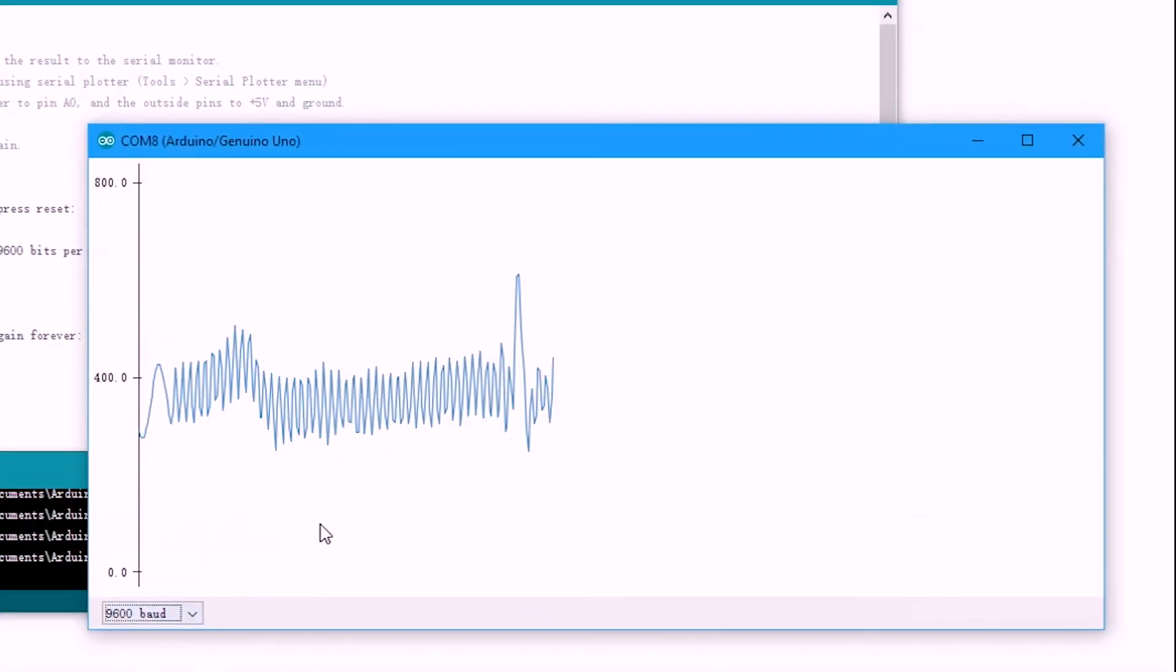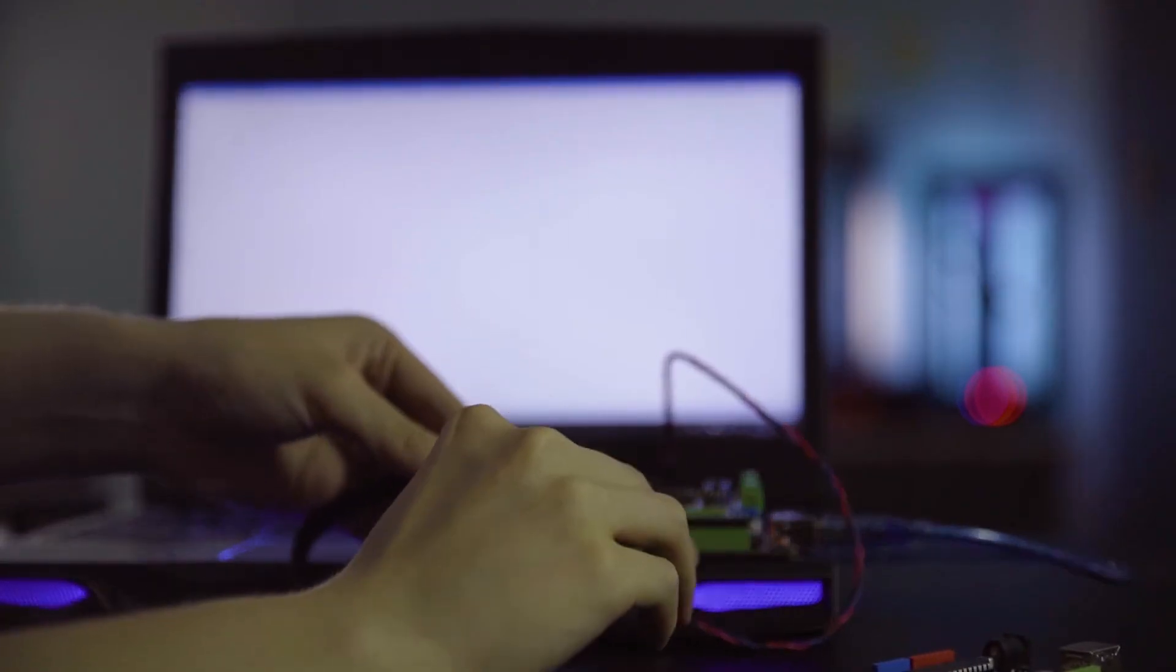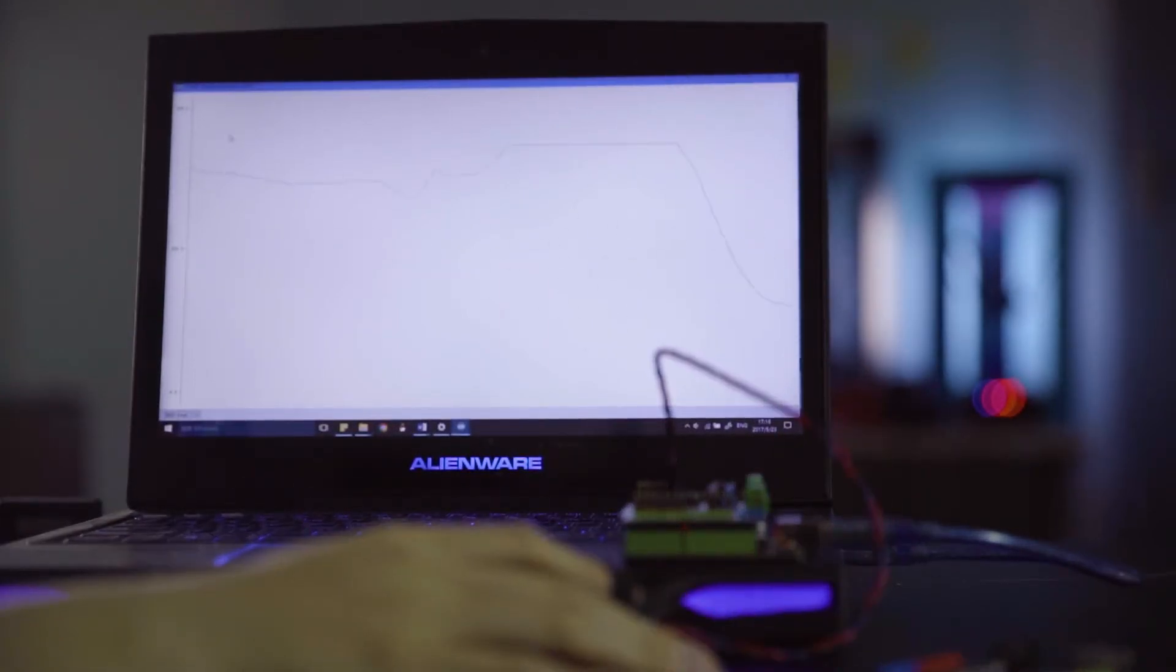Once successfully uploaded, open the serial plotter. We will be able to see some random readings. Now put the sensor onto finger or attach to skin, hold still and wait for a few seconds. Heartbeat will be shown in the monitor.